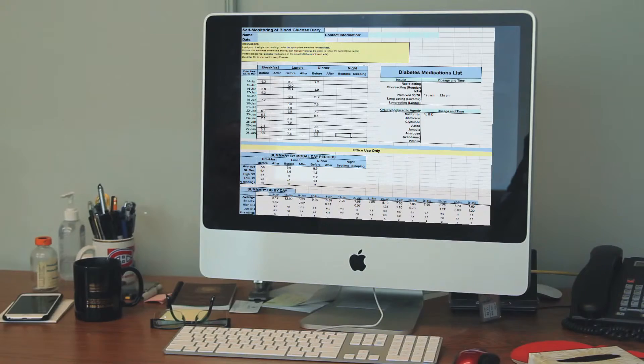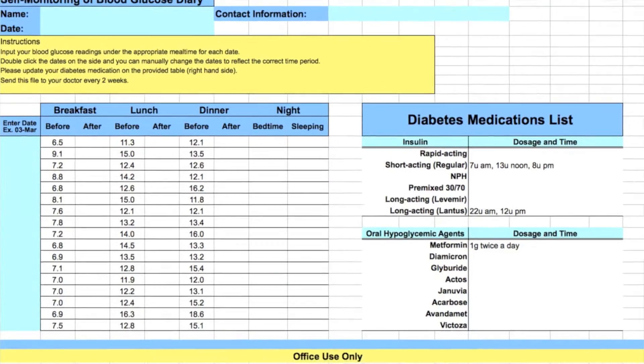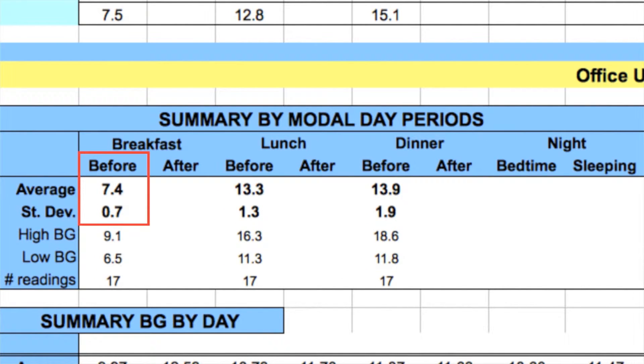Do you have an example of what you would do once you see the numbers? Let's look over here on the screen — I've got a number of reports here that I use as examples. Here's a patient who's reported to me. You can see this patient has a very nice blood sugar in the morning, and the standard deviation is quite low, yet during the day the blood sugar is very high — but the standard deviations are low as well. So I can say reliably that whatever this patient is doing to control their fasting blood sugar is okay, and they need more therapy during the day — in the form of increasing their insulin at mealtime.